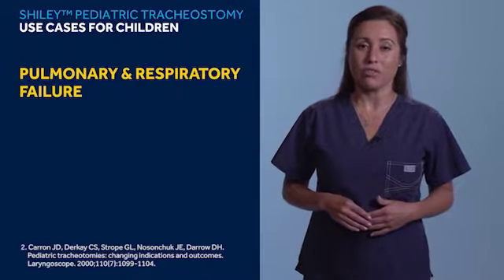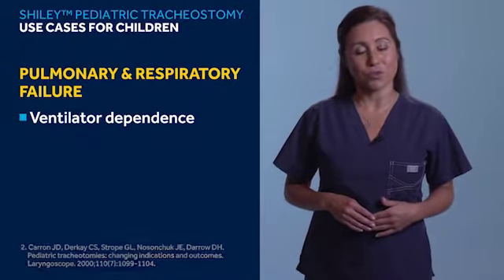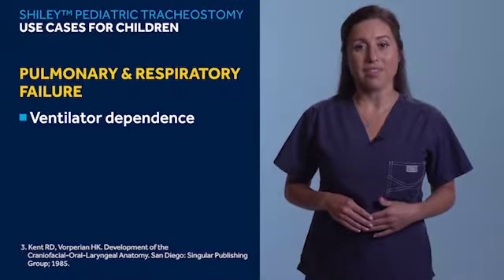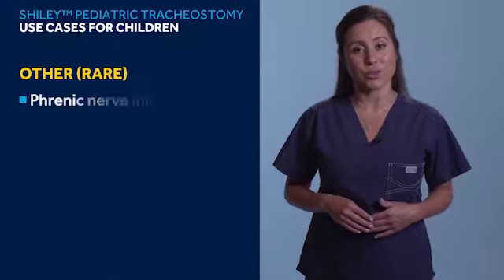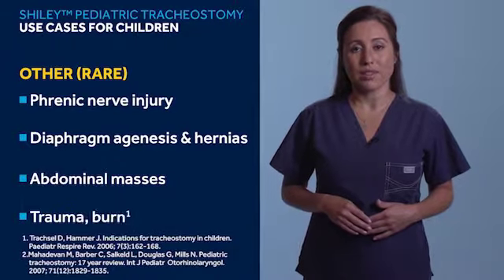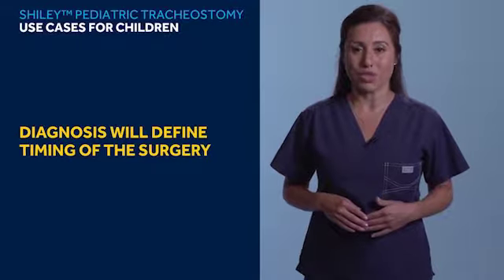Pulmonary and respiratory failure in children who are ventilator dependent may drive the decision to perform a tracheotomy. Finally, there are a number of other rare conditions that can drive the need for this procedure. The diagnosis and medical status will define the timing of the tracheostomy procedure.